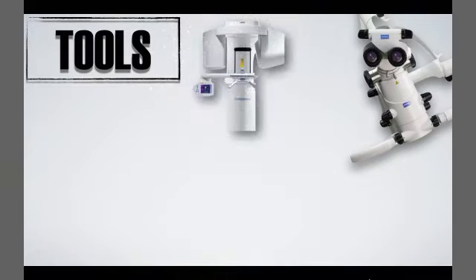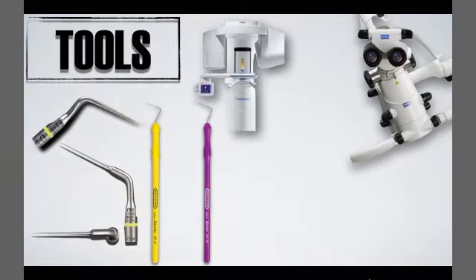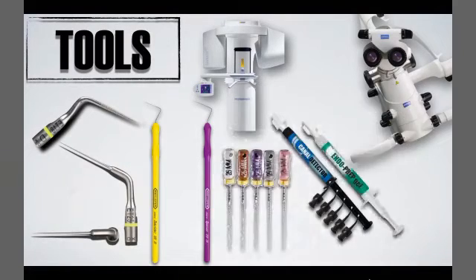Another important tool is the 3D cone beam. It guides us to the root canal orifices and gives us much important information about the calcification. Also, ultrasonic tips, diamond, stainless steel, non-coated and coated tips, micro openers, stiff manual files like C files, for example, canal detectors like methylene blue, and also EDTA gel for the glide path management of the manual files.